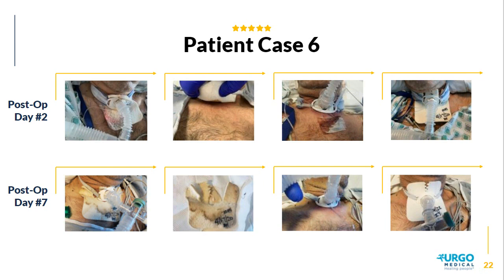The sutures were removed. You can kind of see in the second photo that we have that much soilage, but in the third photo, after removal, you can see that the skin still appears clean, dry, and intact. And again, the final photo shows a successful application of this Draw-Tex dressing.